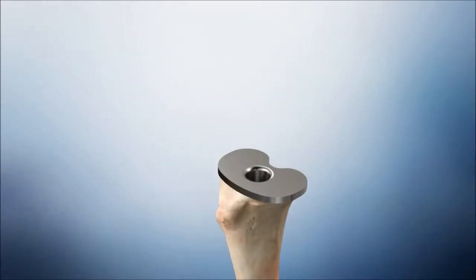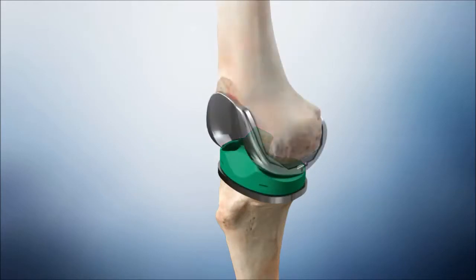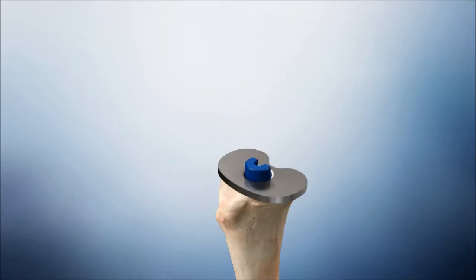A final trial with the implants in place may be done by utilizing the revision trial post set into the implanted MBT revision tibial implant and utilizing the appropriate insert trial. Fully extend the knee to maintain pressure as the cement polymerizes. Once the cement has polymerized, remove the insert trial. Introduce the final insert implant.